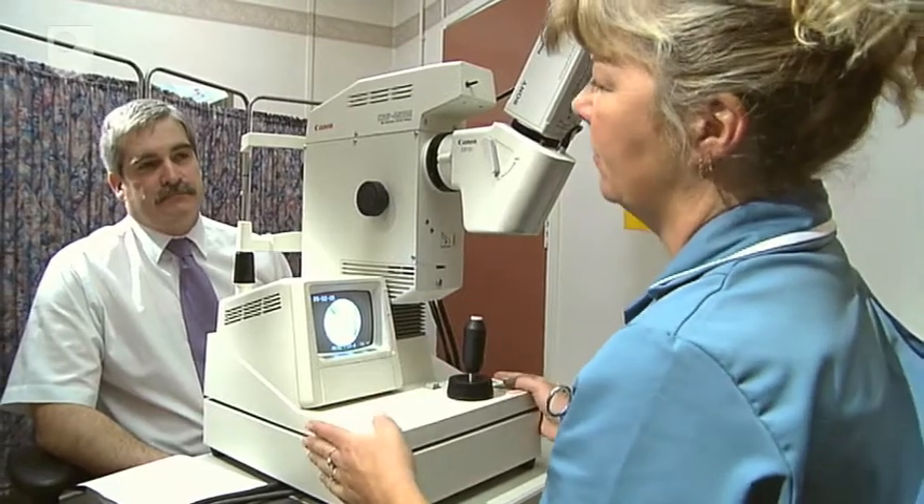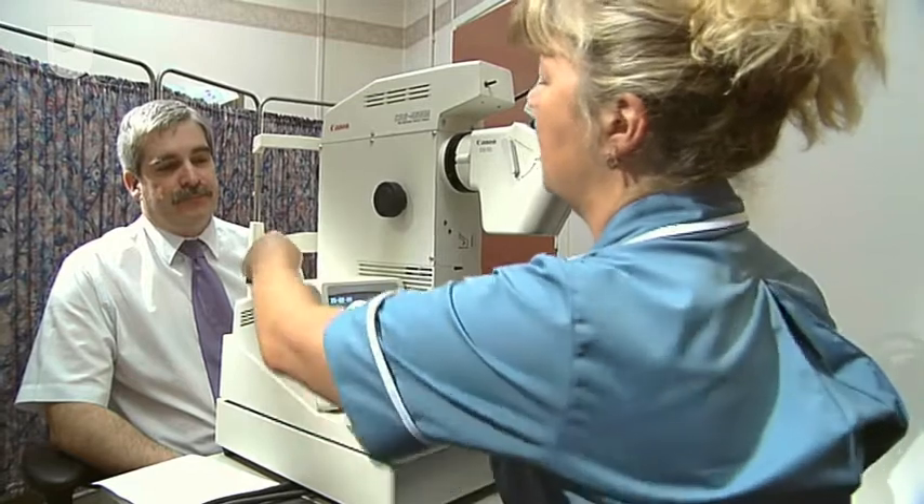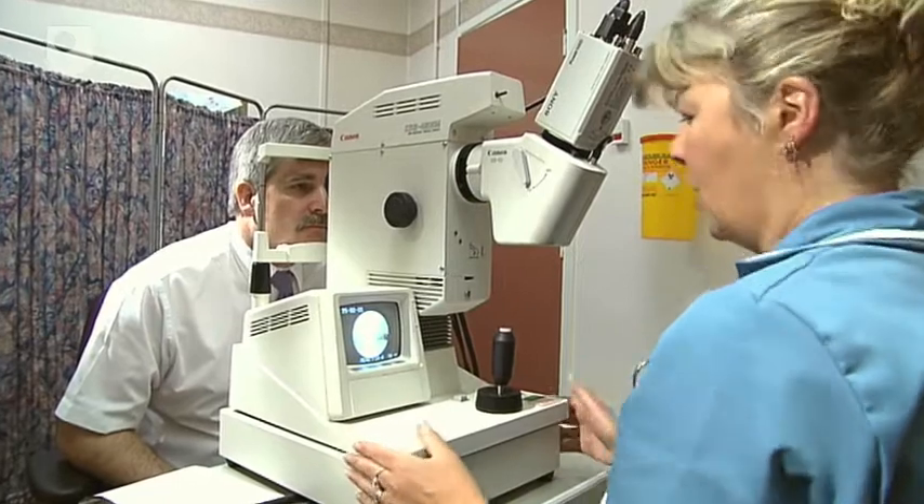Hello, my name's Janice. You've had your eye drops in so that your pupils are nicely dilated. If you'd like to pop your chin on there and we'll take some photographs of your eyes.